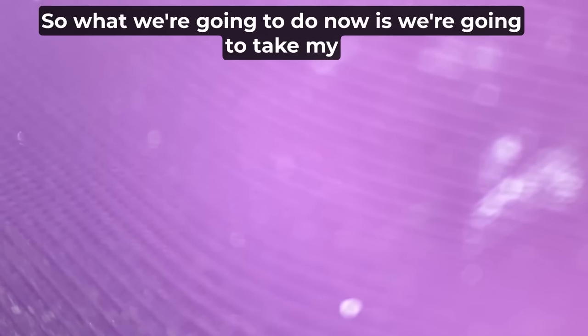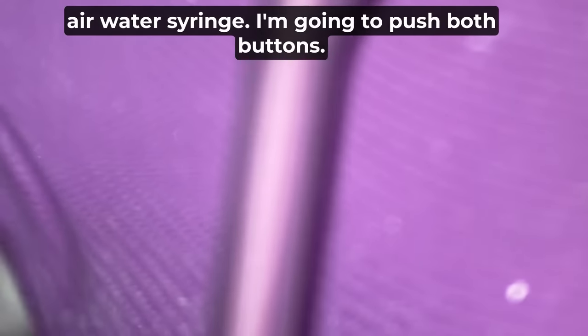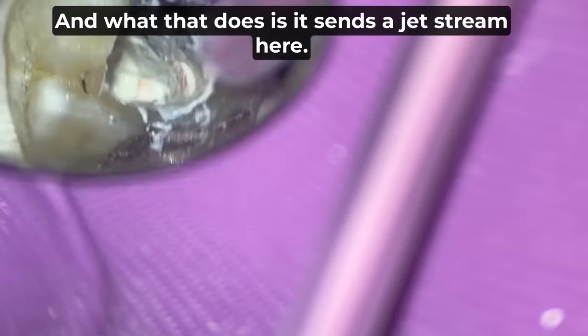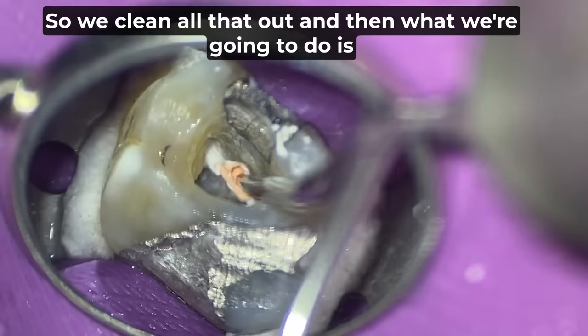So what we're going to do now is take my air water syringe. I'm going to push both buttons, put my finger over the preparation, and hit the gas on both buttons. What that does is send a jet stream of air. You can see air and water coming, and watch my air water syringe tip, it flows all over the place. Now we clean all that out.